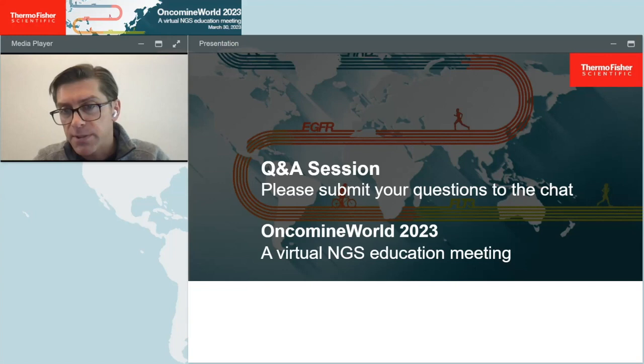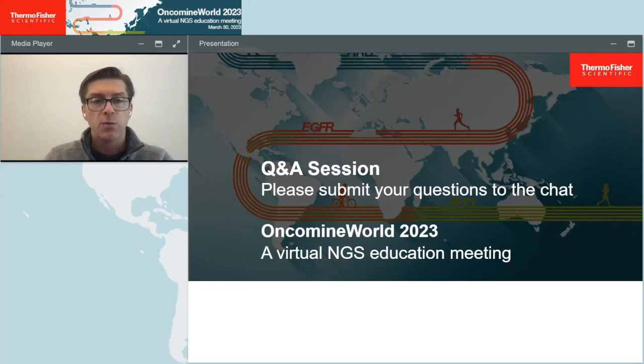See the last question here. How is the chip stored after usage if not all lanes were used? So because we have the 4 lanes on the GX5 chip, and you can select to use just one of them when you initialize the instrument, that would leave unused lanes of the chip, so 3 lanes left over.